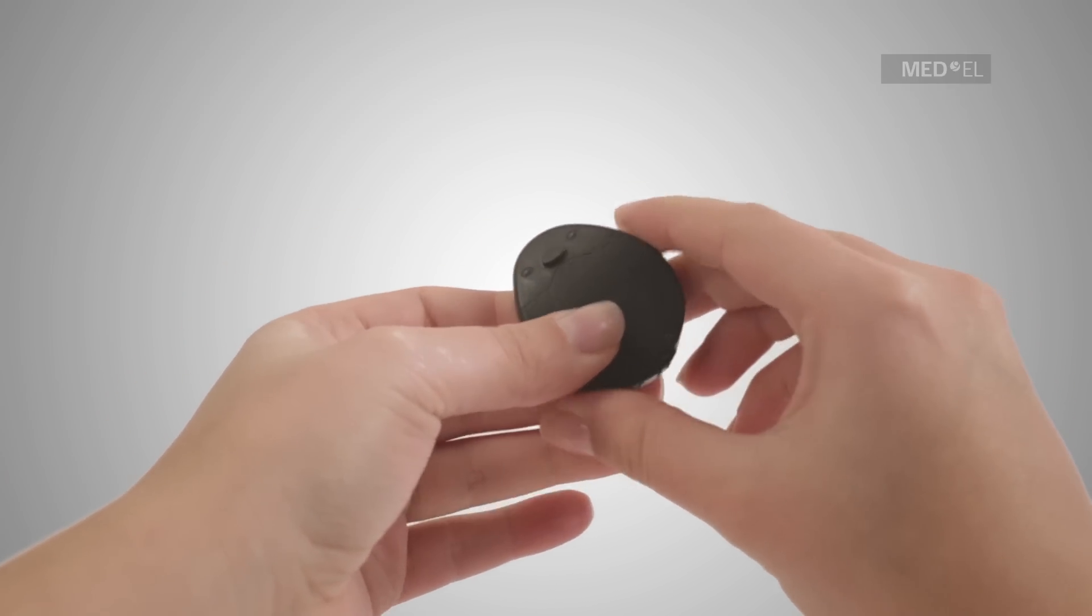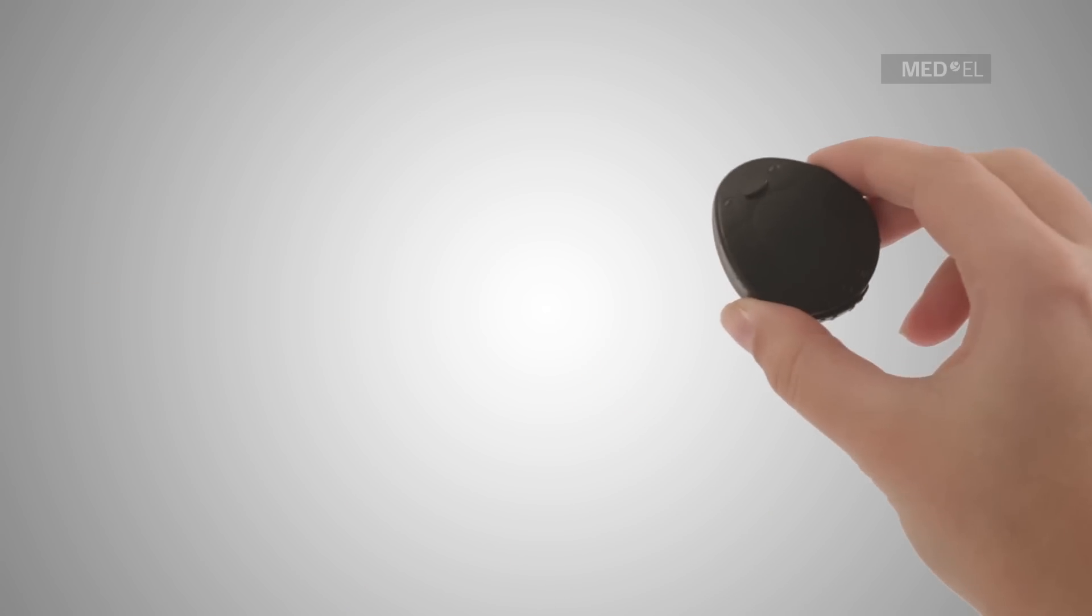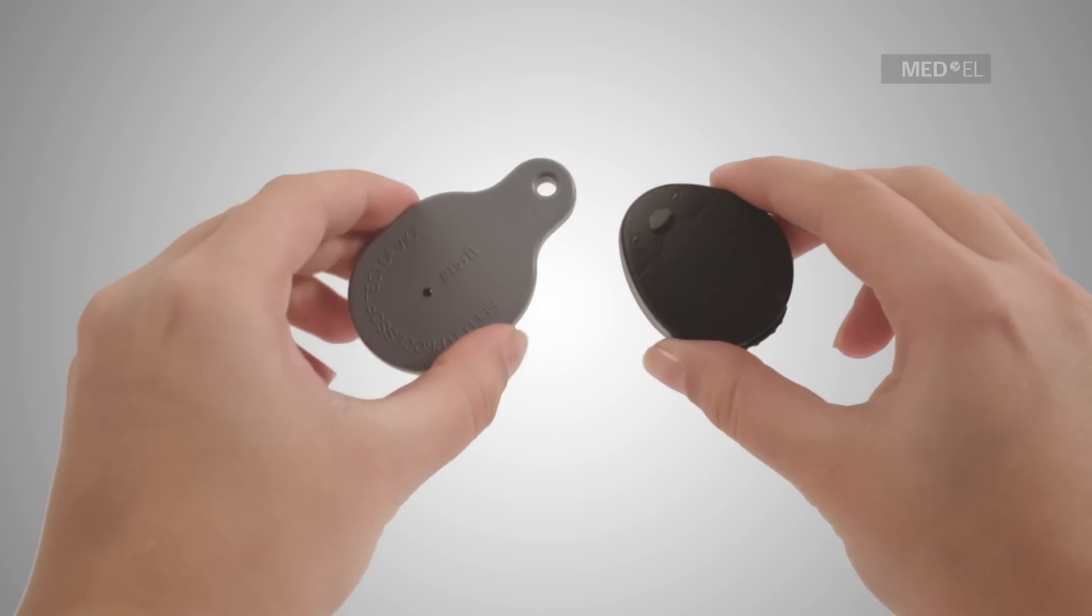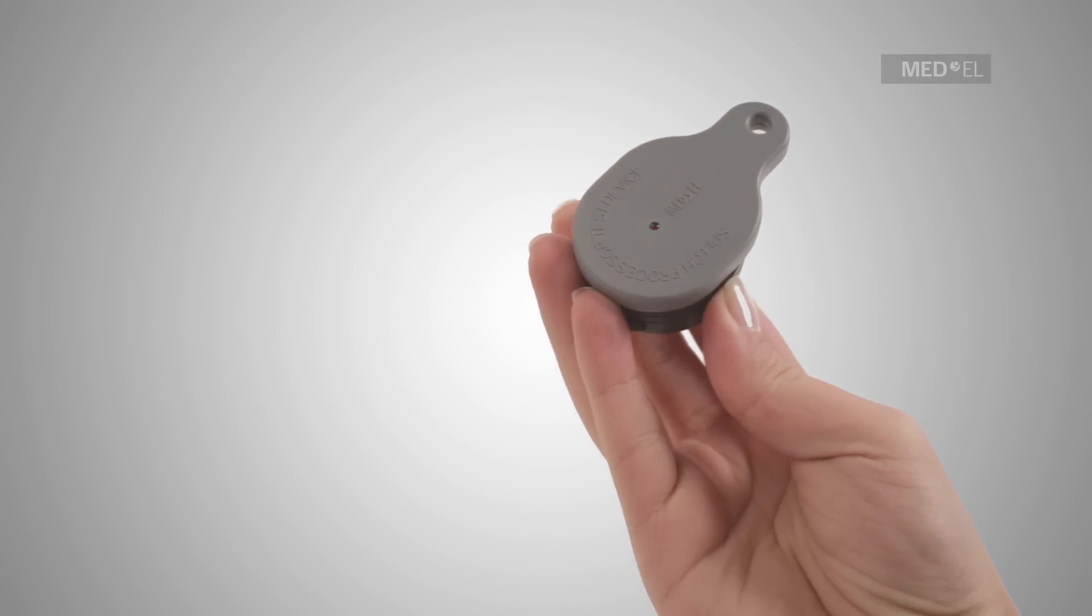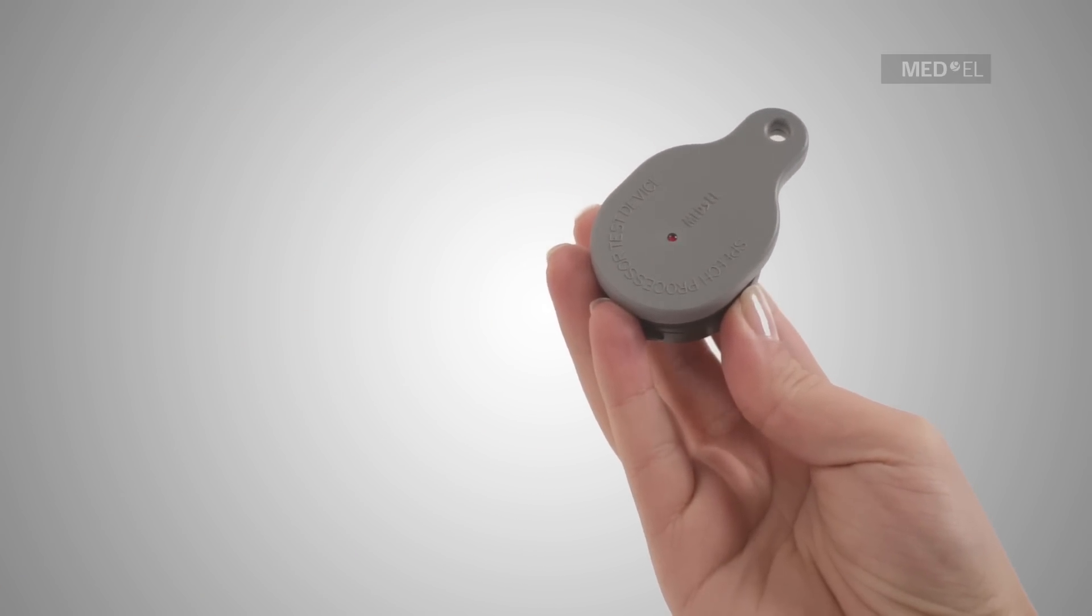After first switching it on, place the Rondo underneath the Speech Processor Test Device. The Rondo should be upside down and the red indicator light of the Speech Processor Test Device should be face up.